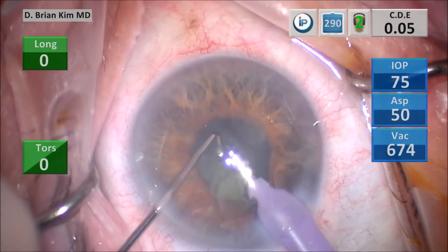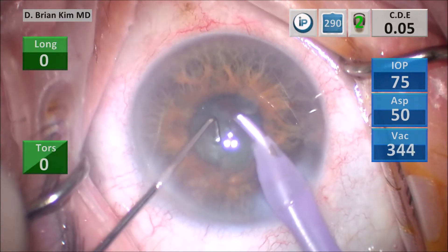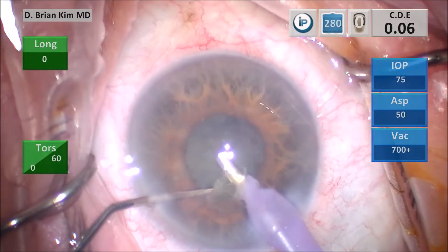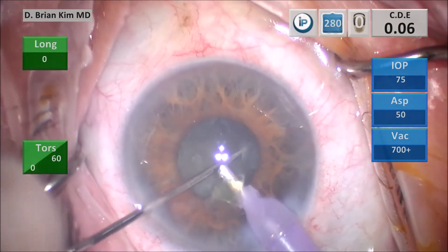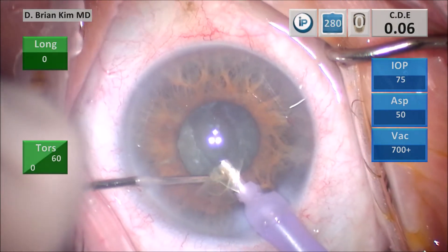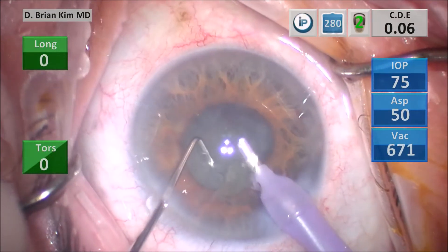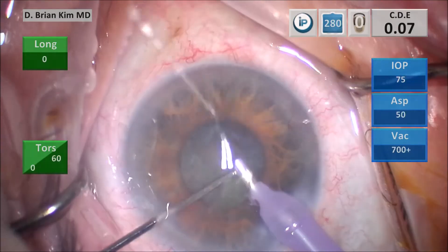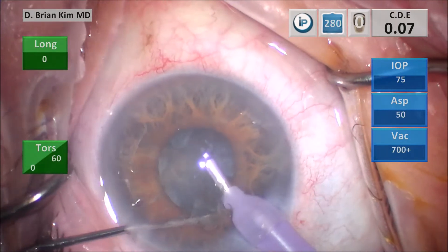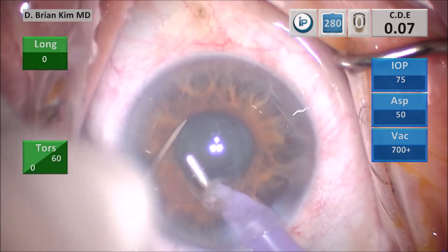Rings have issues also — they're not perfect. You can get iris trauma, sphincter damage, and pupillary distortion. Sometimes rings can disengage from the pupil and end up underneath the iris or get dislodged, and some people have caused capsular tears. Certainly with proper technique, rings work fine. Same thing with hooks — hooks have less of an issue because you're fixing the sclera, but that's more maneuvering and more instrumentation. You have to use those instruments if you depend on a red reflex or are afraid of grabbing the iris during cataract surgery.